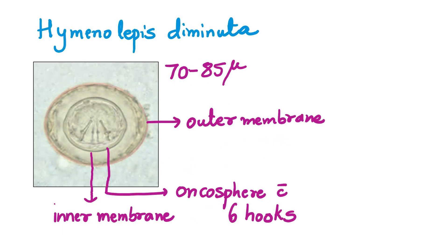Moving on to the rat tapeworm, Hymenolepis diminuta. When man becomes the host, the eggs found in stool specimens are larger — 70 to 85 microns in size. There is an outer shell and an inner shell. Between these two, there is nothing special. Sometimes we can see some refractile granules, but the polar filaments, yolk granules, and polar thickenings are all missing. Within the inner shell, we can see the hexacanth onchosphere with six hooks. This concludes Hymenolepis nana and diminuta.